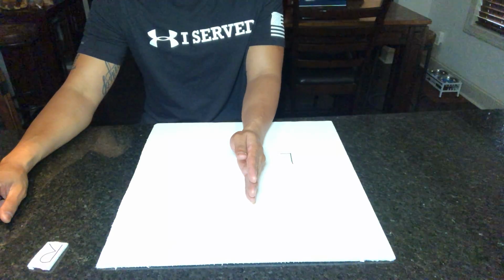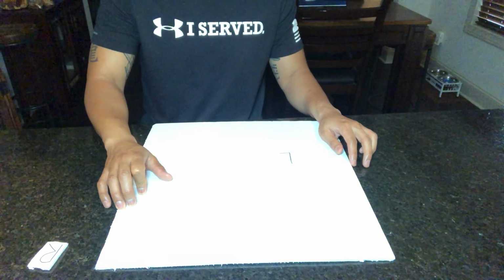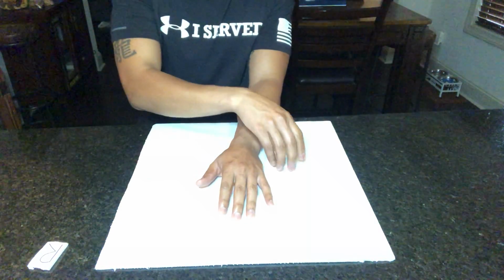All right, we're going to move on to wrist views. Let's go ahead, and again, left hand is the affected hand. We're going to start out with the PA wrist.